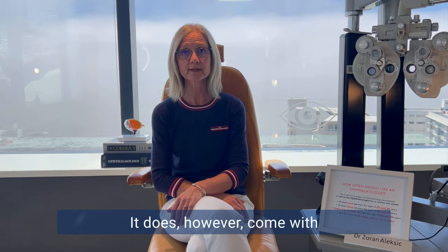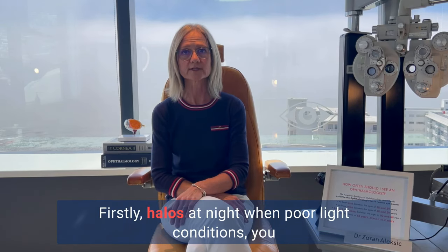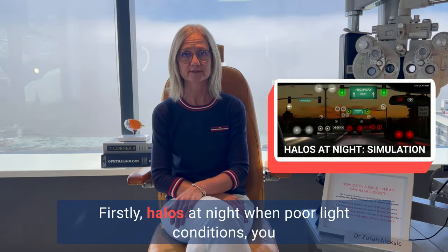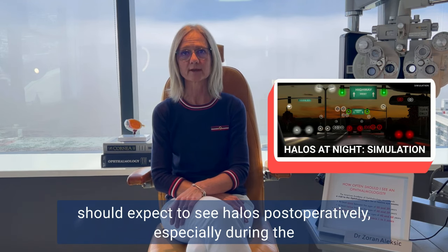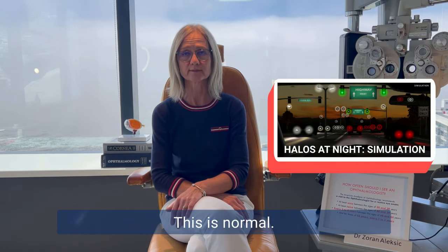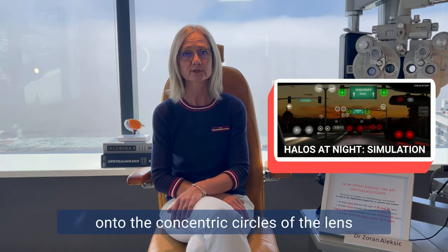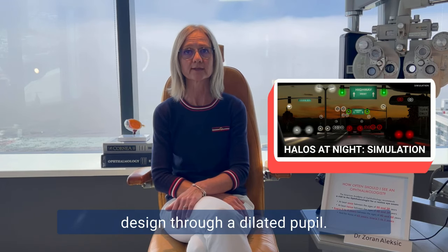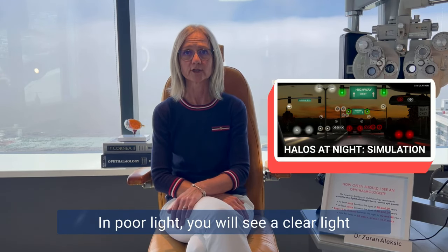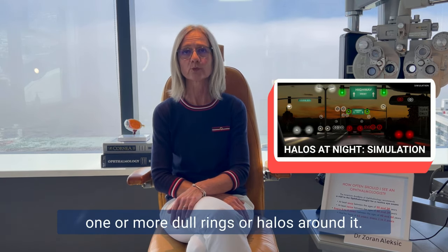It does, however, come with some potential side effects. Firstly, halos at night or in poor light conditions. You should expect to see halos post-operatively, especially during the first couple of months after your surgery. This is normal. These halos are caused by light falling onto the concentric circles of the lens design through a dilated pupil in poor light. You will see a clear light source, like when looking at a traffic light, with one or more dull rings or halos around it.